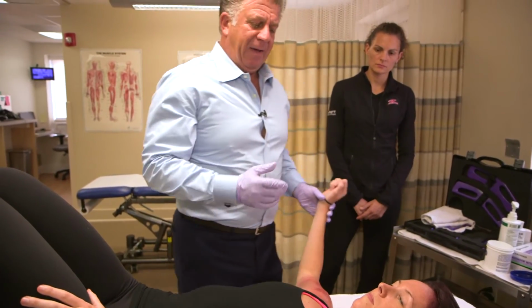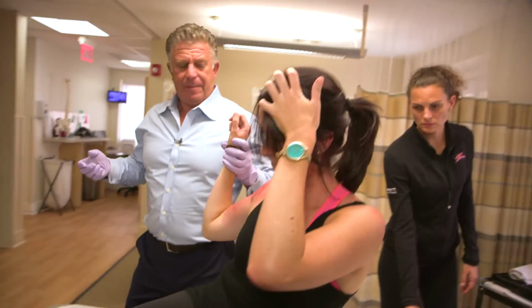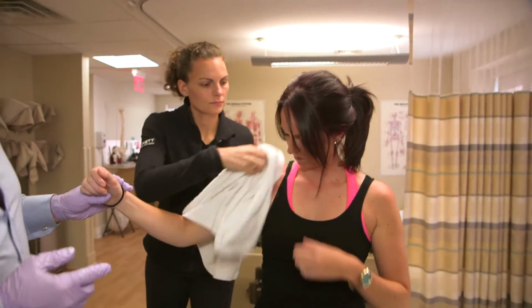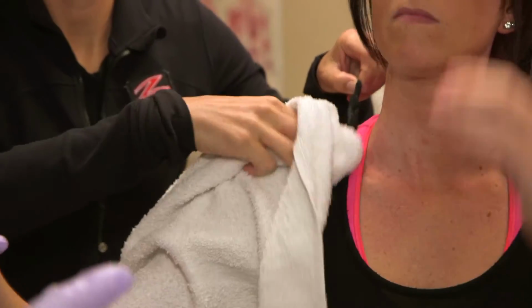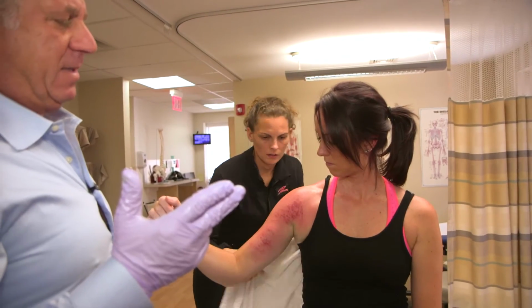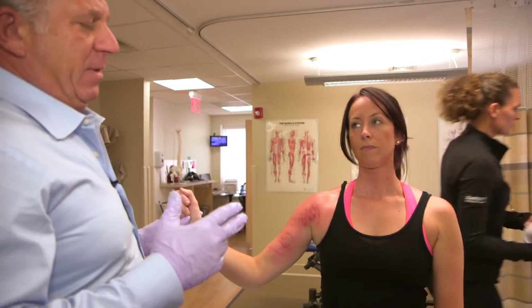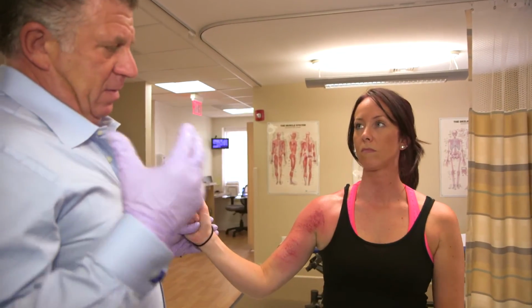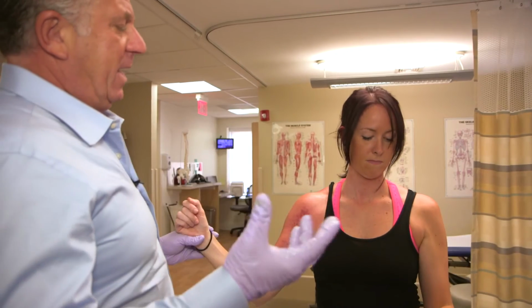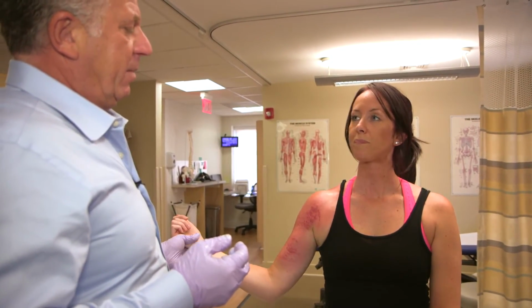We will now have Francie sit up. Francie, if you were to sit up, please. Jen, let's just get this wiped off. We ask our clients to always drink at least 24 to 36 ounces of water immediately after the treatment. And for the next day or so, to continue to drink water as much as possible to flush out all of the junk that we've just cleaned off the muscle.